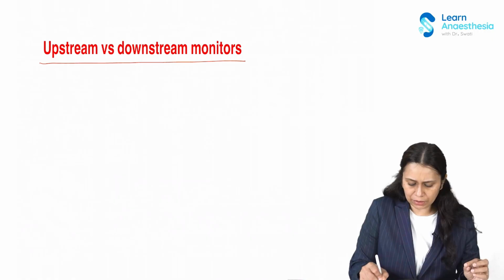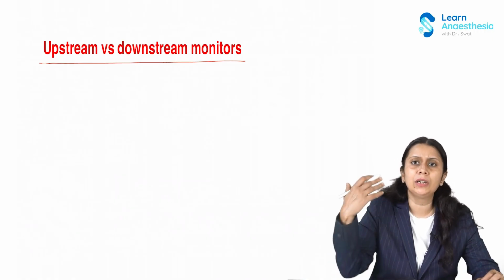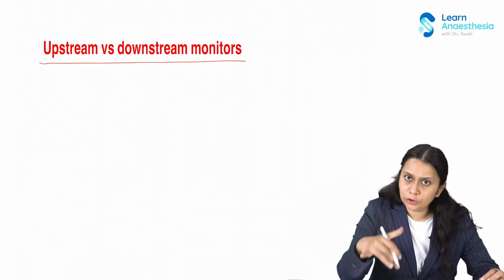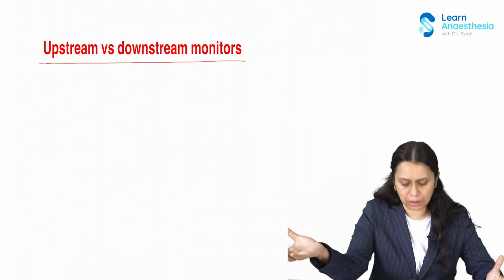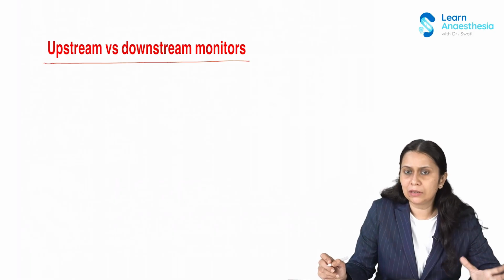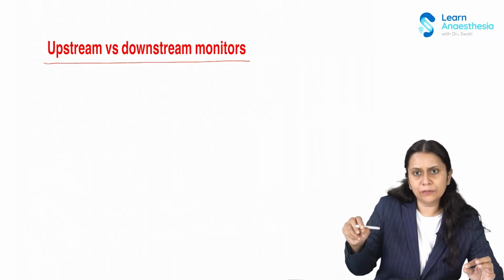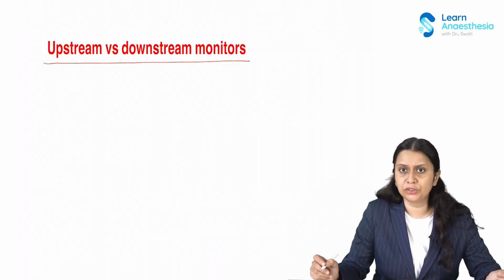Okay, so these monitors can be divided into upstream and downstream monitors. Upstream monitors are what we were traditionally using. The traditional monitors were upstream monitors, and a lot of newer monitors are upstream monitors, but a lot of newer monitors are downstream monitors also. So what do I mean by upstream and downstream? When flow, pressure, etc. are measured, that is the condition of the heart, the vena cava, the great vessels, then it's called an upstream monitor. And when the perfusion at the level of the tissue is measured, then it is called a downstream monitor.